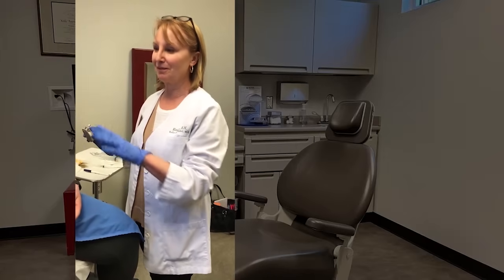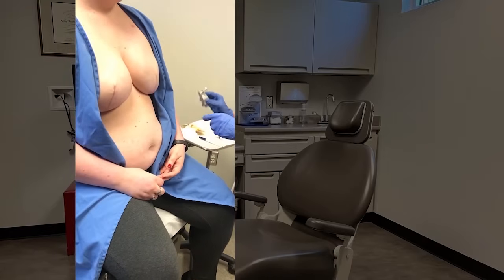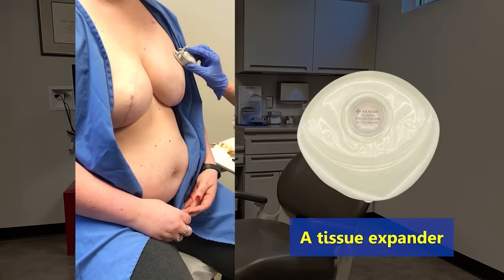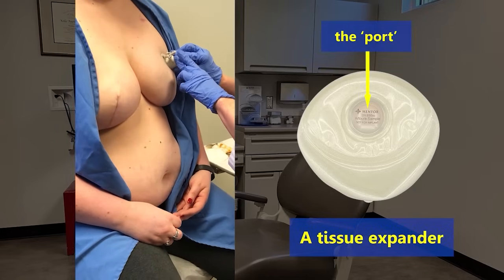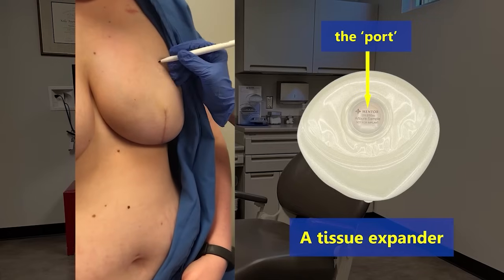This patient is here for an expansion of her breast reconstruction tissue expander. So what I'm going to do is use a port finder, put it on her chest, I move it around, and it tells me where her port is. So I push down and make a little mark on her skin and then I circle it.